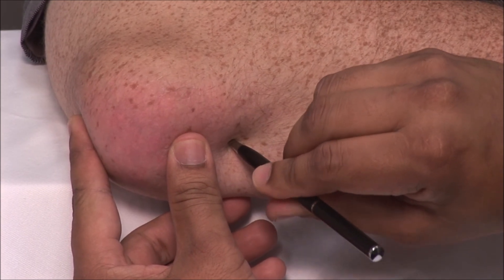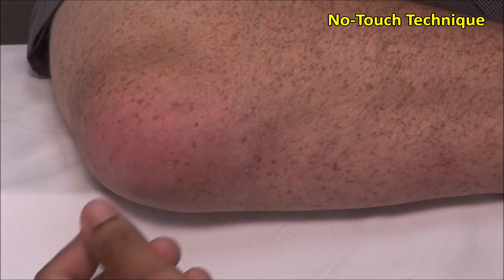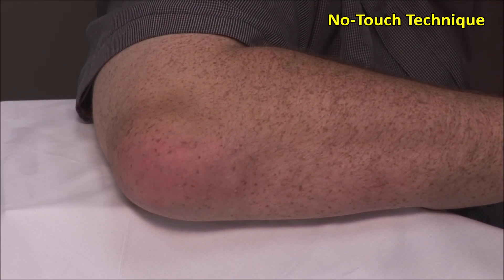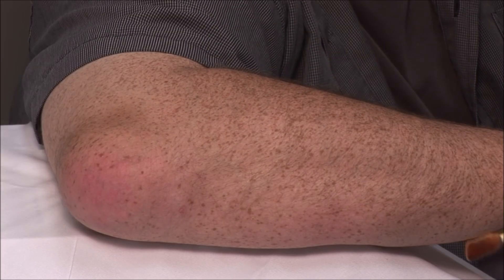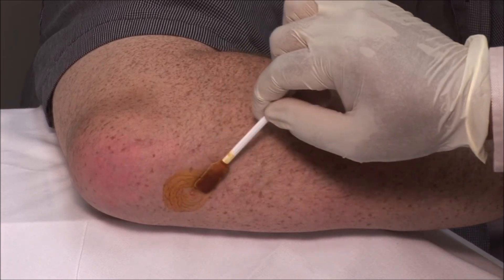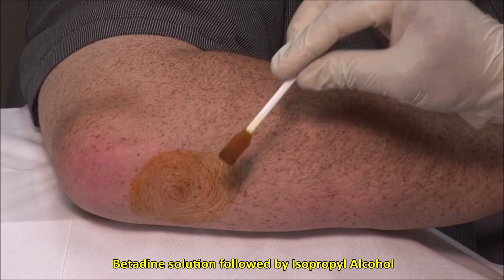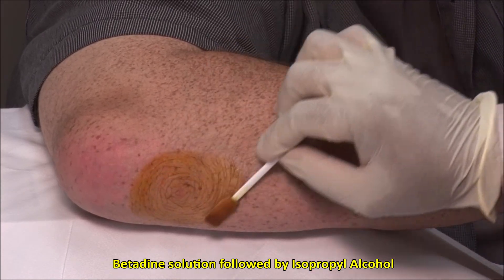These injections should always be done using sterile precautions. A no-touch technique is used, meaning that once the area is cleaned, it must not be touched with anything but sterile needles. Scrub the site and then clean in an outward fashion. Here I am using betadine solution and following this by isopropyl alcohol.